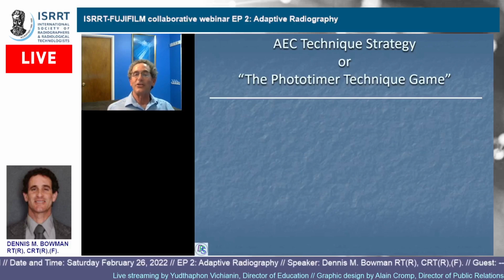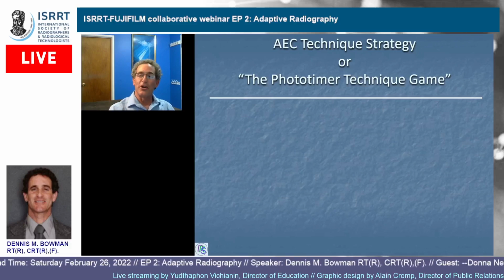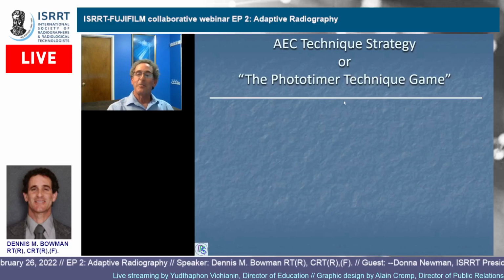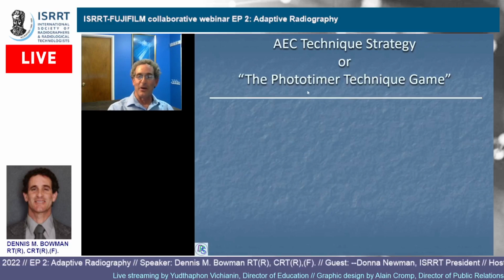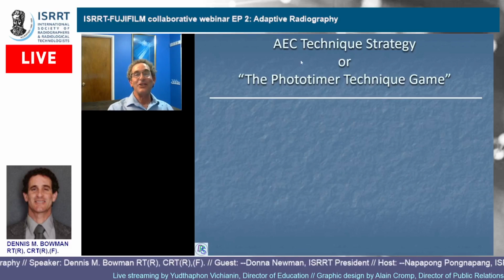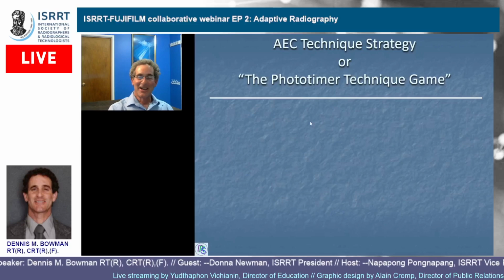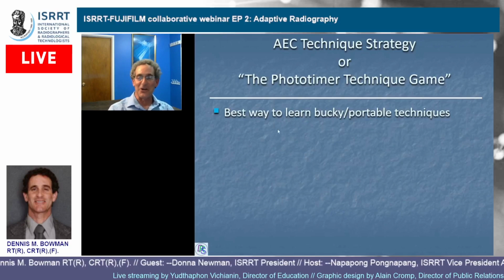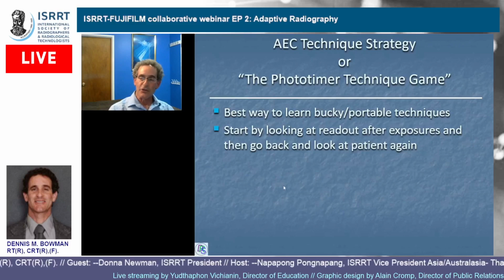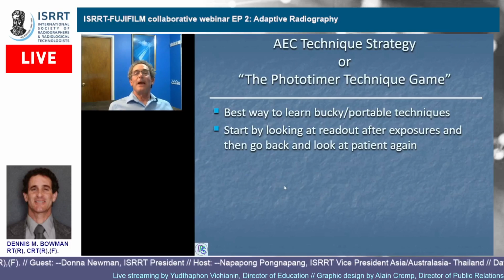then you really have to just learn techniques again. So the greatest way to learn it is I used to call it the photo timer technique game, but then all the instructors came up to me and went, there hasn't been a photo timer in like 20 years, man. So they're all called AECs. It's like, okay. So it's the AEC technique strategy is what you can also call it. Doesn't matter what you call it. But it's the way to learn your techniques. So what you're going to do is you're just going to make the exposure.